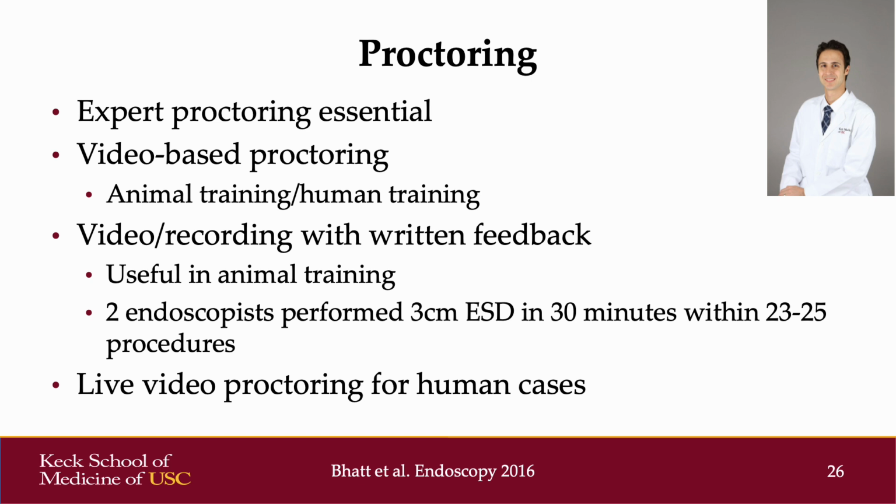Expert proctoring is essential to learning how to perform ESD in human patients safely. Video-based proctoring can be used both for animal training and human training. One study looked at video recording of the procedures in animal models with written feedback from a proctor mentor. And this was very useful in animal training to endoscopists who were able to perform a large 3-centimeter ESD in 30 minutes within 23 to 25 procedures performed in animals. Live video proctoring can also be used for human cases as well.